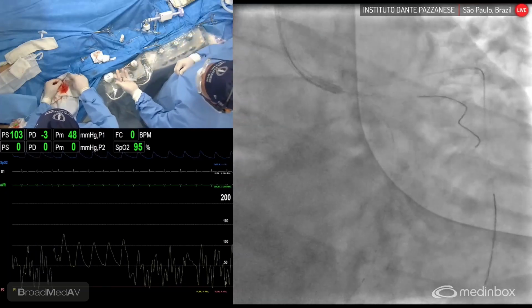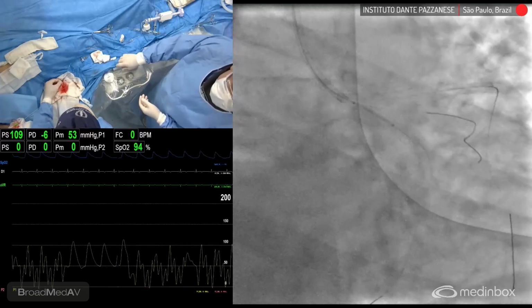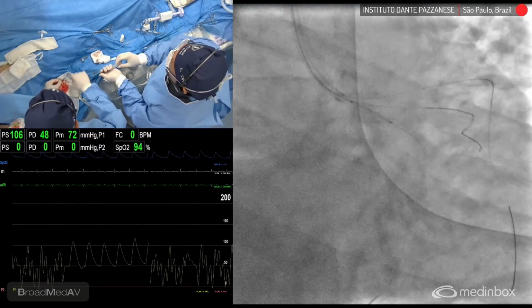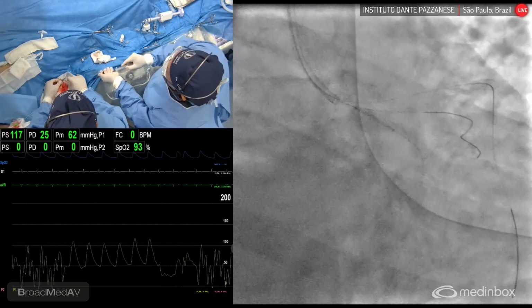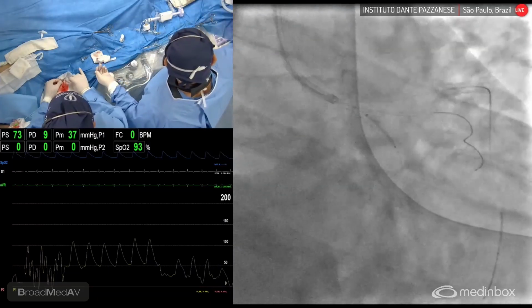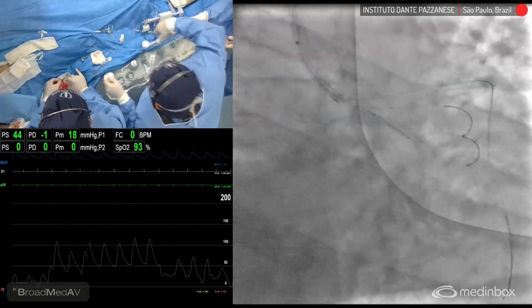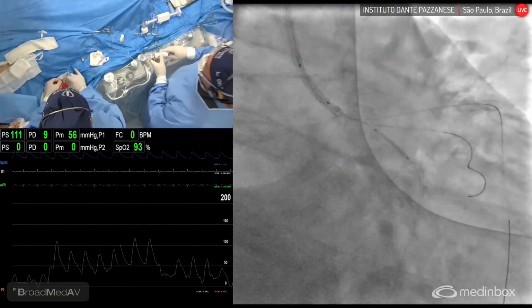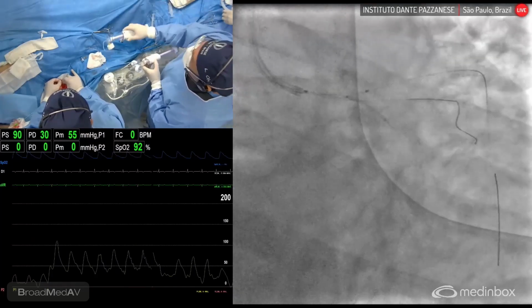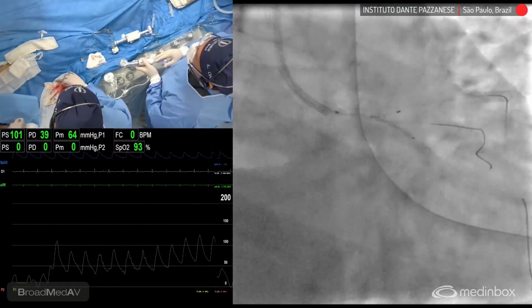Perhaps because we have a really short left main, Ricardo. I don't know if culotte could be easily done here. It would be time consuming and a lot of work, but it can be done. So a 3.5 by 12 stent in the circumflex, and you already have a balloon that you have to park, right, Rodolfo, to do this technique? You have to do the balloon in the LAD as well.